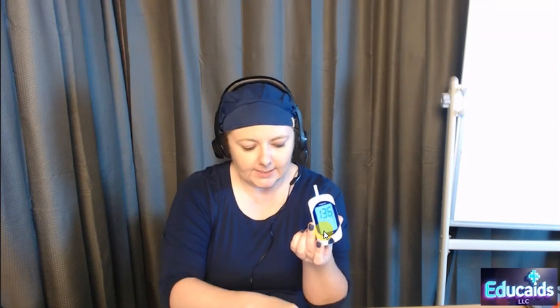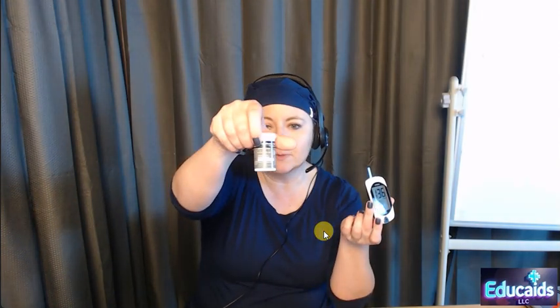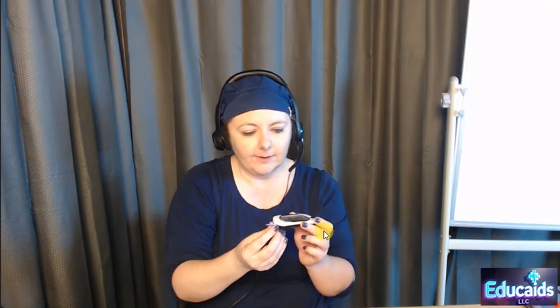And then it gave me a reading of 136. So this is considered normal because on my packaging it says 70 to 150 is what is considered normal. Okay, these drops are good for 90 days once they're opened. And of course you would have to watch for the expiration date because you can't use them when they're expired. Same with your strips. Your strips will always have an expiration date on them. You can't use them when they're expired. Okay, so we're going to get rid of that. Turn that off.